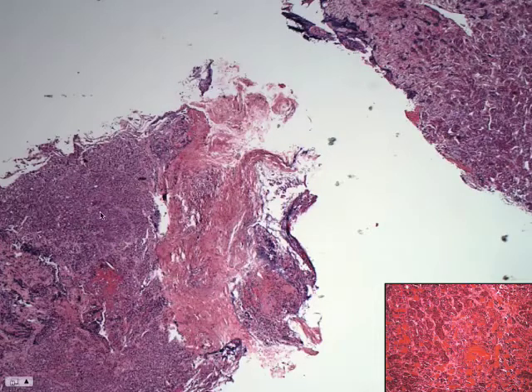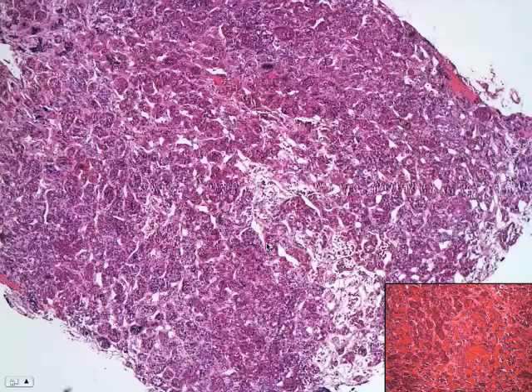There is a little bit of architecture here, and you can see some banding going on, and it does get a little bit tighter. Still not normal as we go through, and unfortunately by the time we did the reticulin, this piece that's on the lower left was cut through. So I can't prove to you with the reticulin that's an adenoma. I can with the stains though, so we'll get to that.